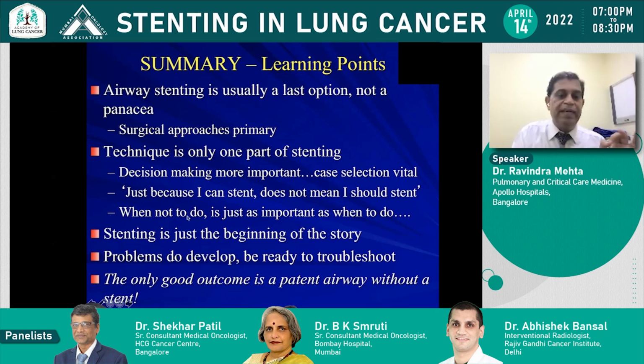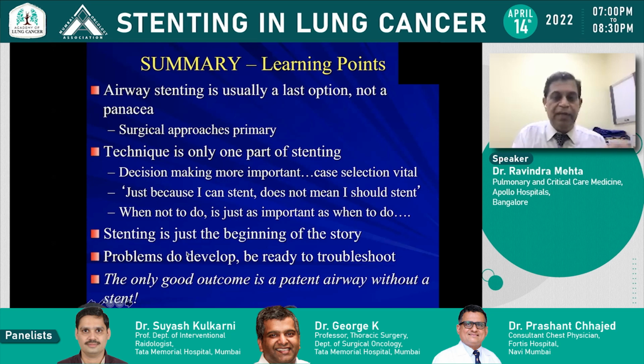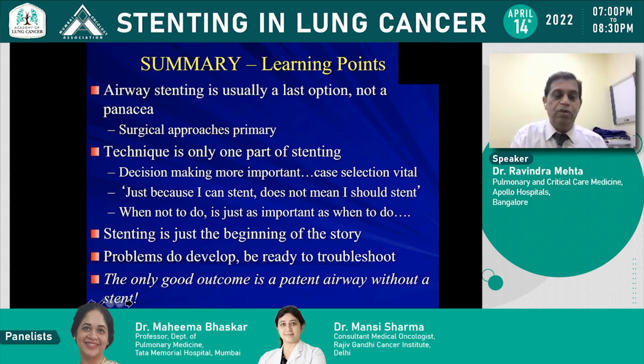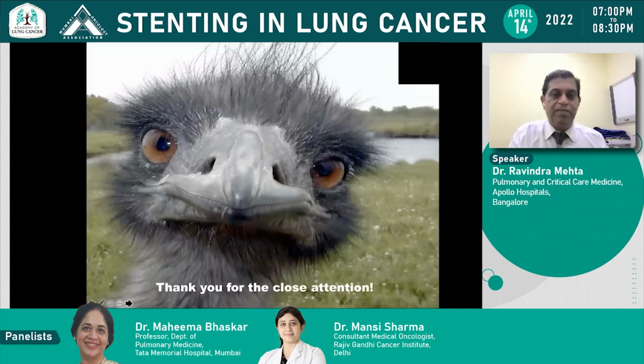As we keep on saying, stenting is just the beginning of the story and has to be put in the context of, first, a comprehensive interventional pulmonary strategy and, secondly, a comprehensive multimodality strategy to do good to your patients, because ultimately we are not trigger happy people. We like to give stents only for people where it's absolutely required. With this particular message, we end the talk.